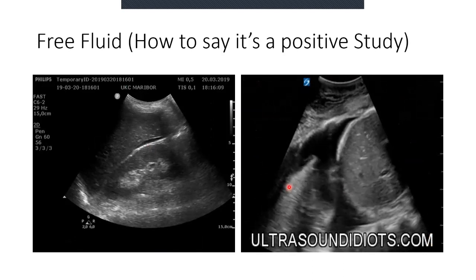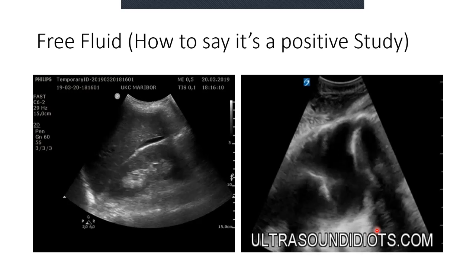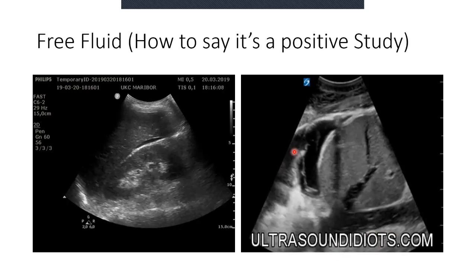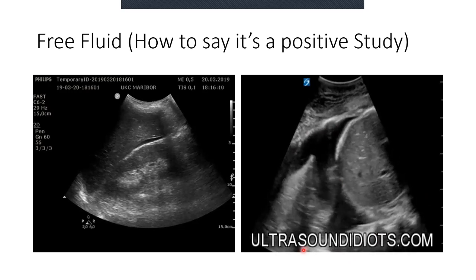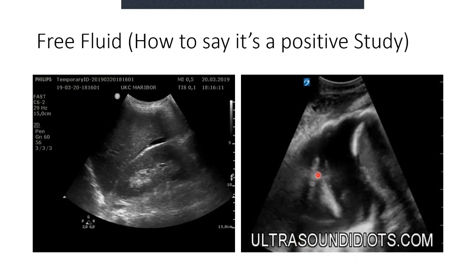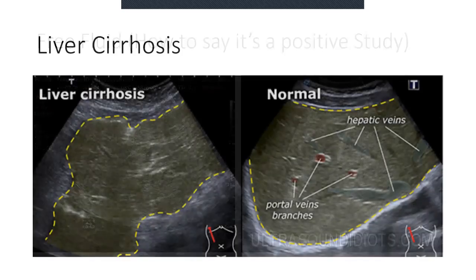Okay. This one here, we are actually seeing the liver, the diaphragm, the spinal stripe that continues. This is a pleural effusion. Let's say it's trauma, hemothorax. And this little wavy thing that you see over there is actually the lung. All right. So I hope I've given you guys some idea of what you need to look at.